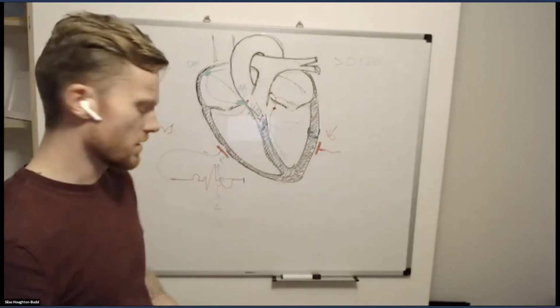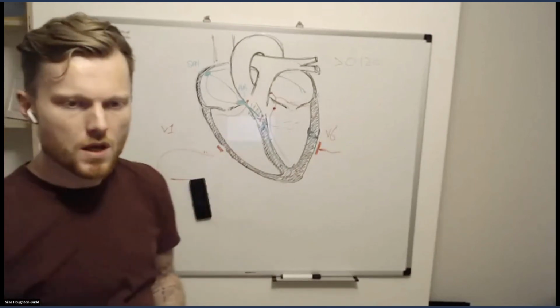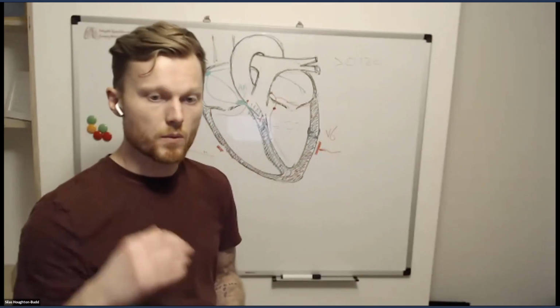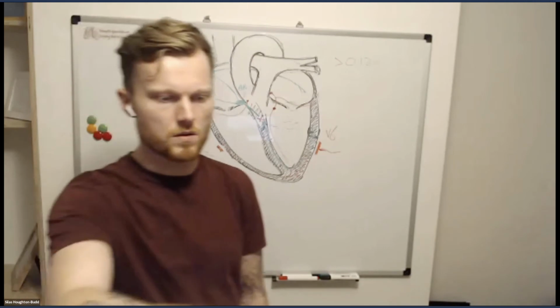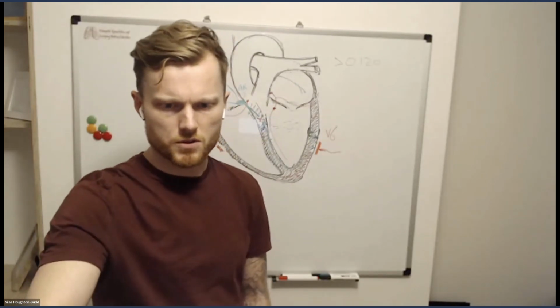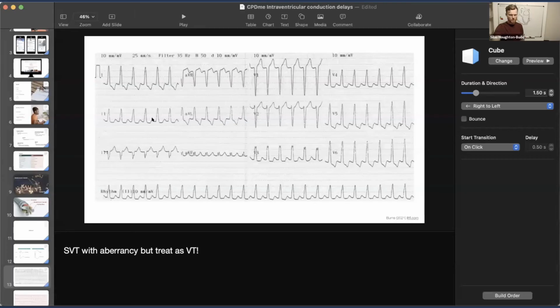So if we have a look at a few examples, I don't want to test people, but just as a quick poll, if I told you this is a patient who was a little bit clammy and had some chest pain, what would be the first consideration with this ECG? I'm not showing the screen, so that'll make it difficult for you to see. Is that showing?